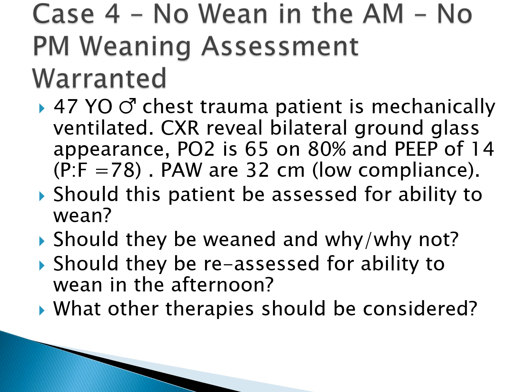Should they be reassessed for the ability to wean in the afternoon? Probably not. They're not going to overcome their ARDS in 5 or 6 hours. What other therapies should be considered? I alluded to the very low tidal volume, aiming to get their plateau pressures equal to or below 30. I gave peak airway pressures of 32, and I verbally said that the plateaus are 30. That's borderline acceptable. But the bottom line is, if you can get the plateaus even to 25 or less, that's even more preferred.